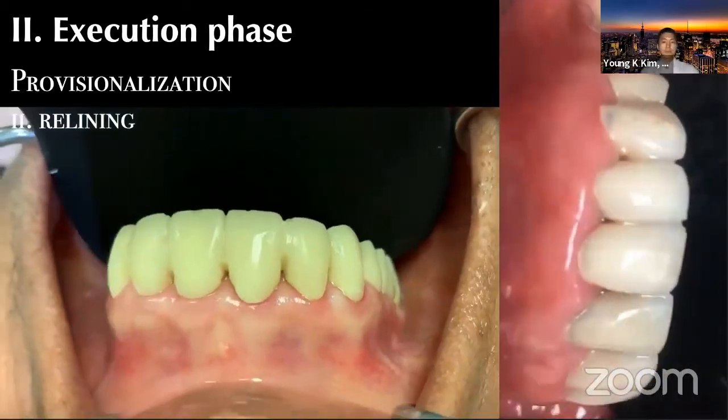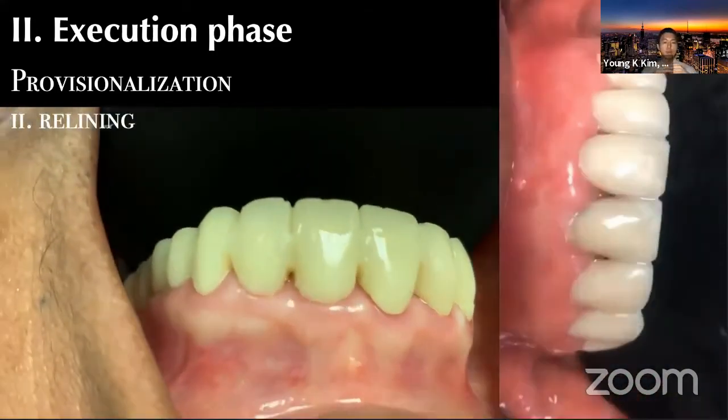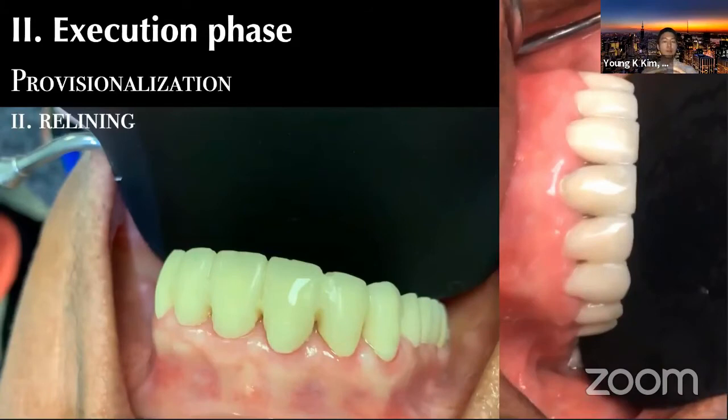And then these are the videos of the full arch temporary after a few weeks, inserting the provisional. Remember, the patient's oral hygiene maintenance is an absolutely critical component. And at this moment in time, the patient and I are in the same boat. There's no question the patient must maintain their oral hygiene. If I don't see the improvement in hygiene, I don't prep the tooth, you know?